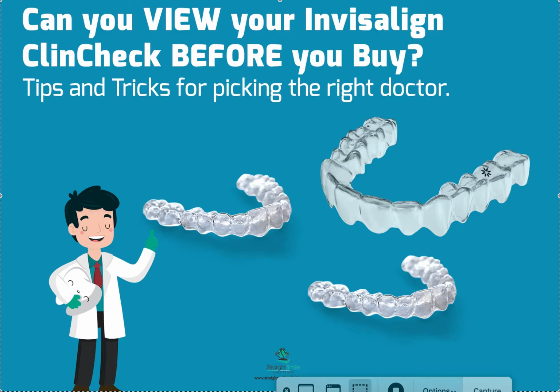Today we're going to talk about a common question I see in a lot of Invisalign consumer-facing forums: whether or not they can view their ClinCheck, which is the branded term for the animation of what your teeth will look like as they move. It's generated by the computer. Your doctor contributes to that, as well as their technicians and their software. But there seems to be a misconception that you cannot view it before you buy.